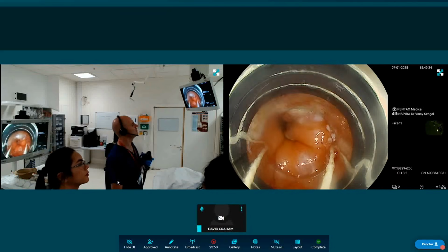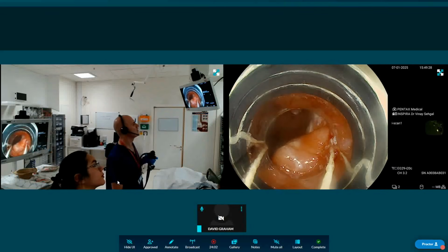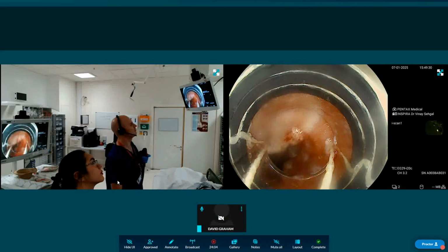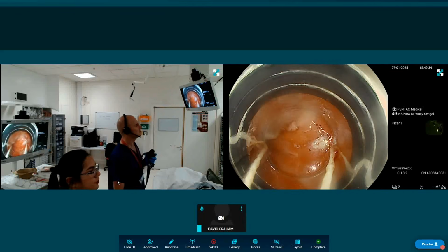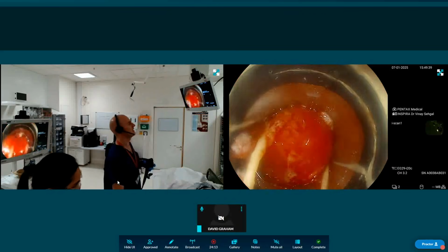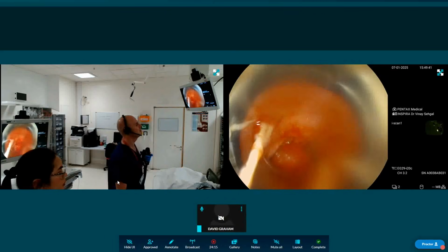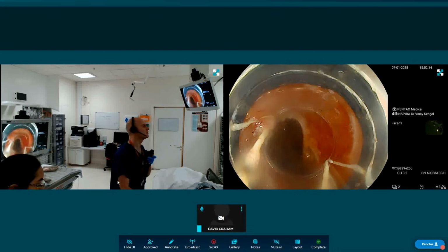So what we now want to do is a tiny bit of overlap. Now we can either come off to the right here, or we can carry on straight down here, whichever one we want to do. I might do the right wall next, so I'm just going to come above it, just about here, accept that there might be an overlap there, and then just again apply the elastic band, perfectly like that one.